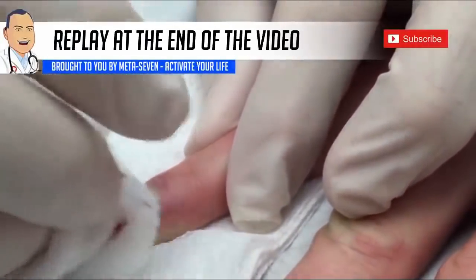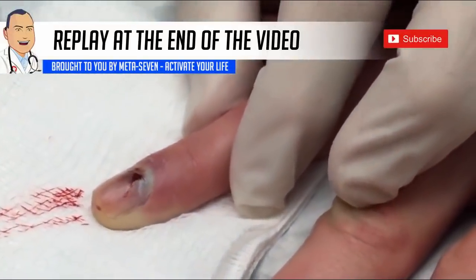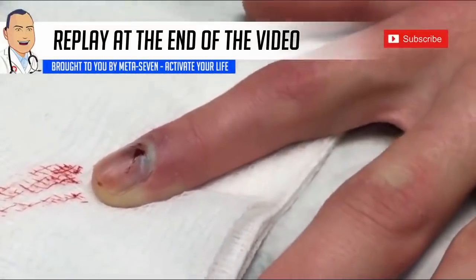There it is. We've relieved the pressure and now the trapped blood is able to come on out. This won't hurt him so much tonight. Good job.